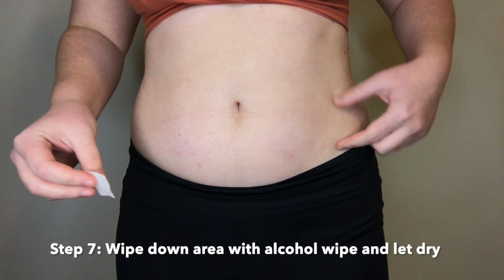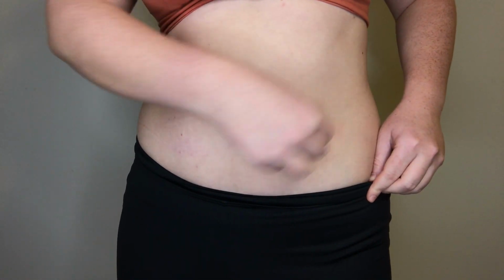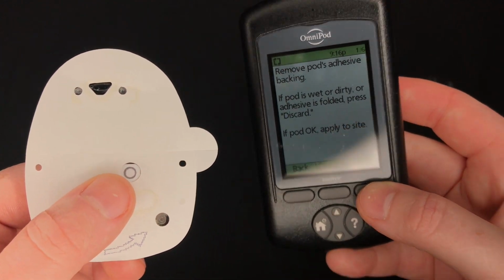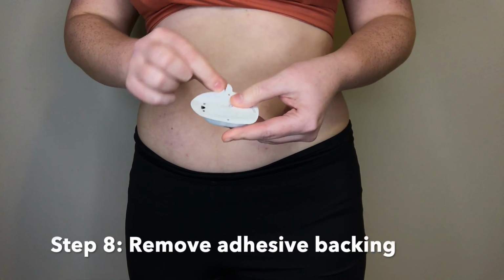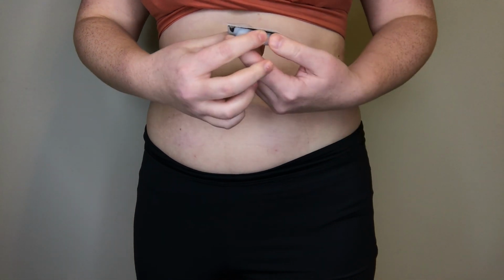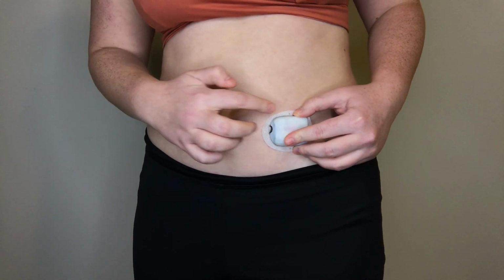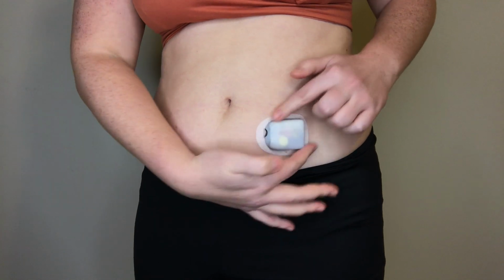Once you've decided an area that you want to place your pod at, make sure you wipe it down thoroughly with an alcohol wipe so that way your skin is clean. Give it a few seconds to dry, and then you're ready to apply your pump. Remove the adhesive backing on the back of the pod, and be sure that the tape does not fold over on itself, because if it does, it's really hard to get it apart. Pick a good spot and gently place the pod on your skin, and then just smooth out all the tape so that way it's firmly sticking to your skin.